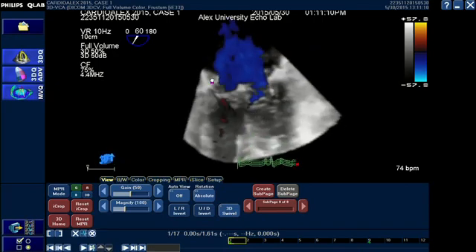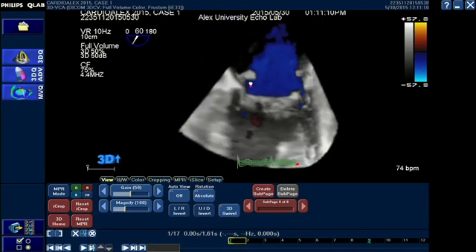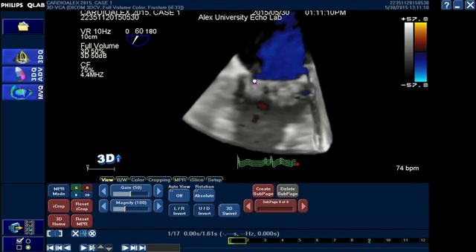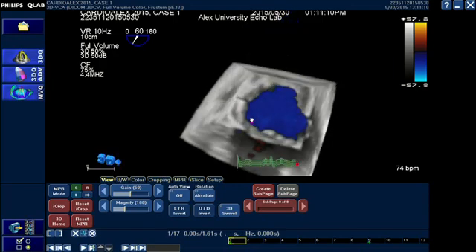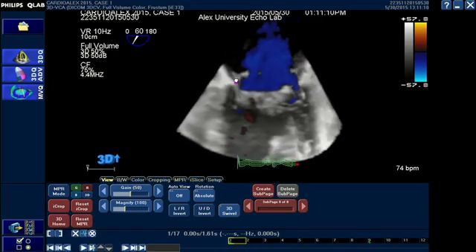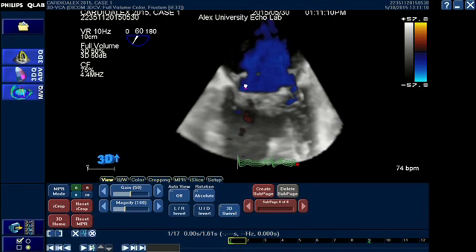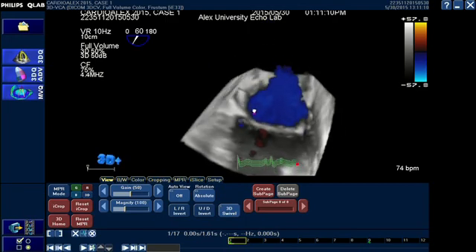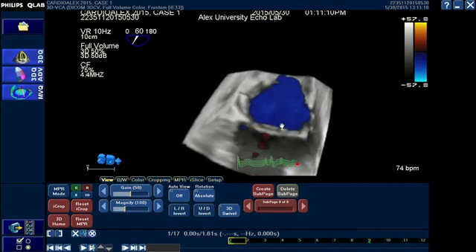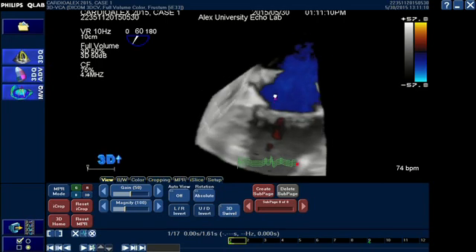As we said, we will see how to measure the vena contracta area in 3D — the 3D VCA. Here we are starting with this color full volume that is showing the mitral valve in gray scale and the mitral regurgitation jet in blue and red.